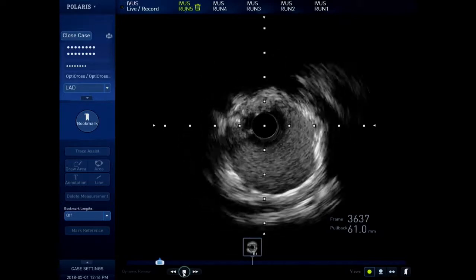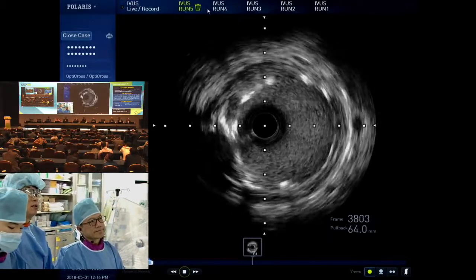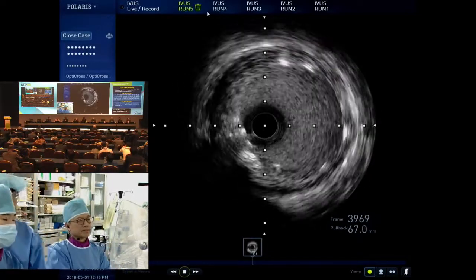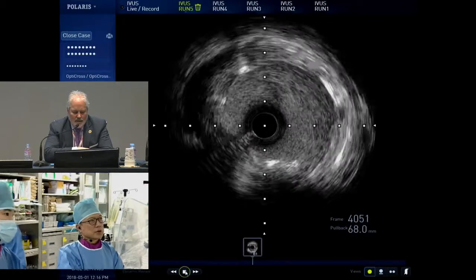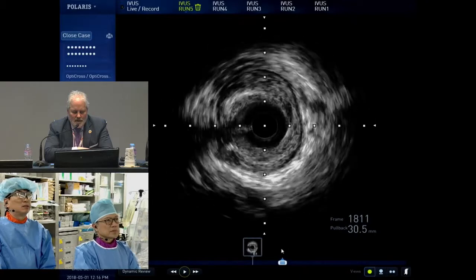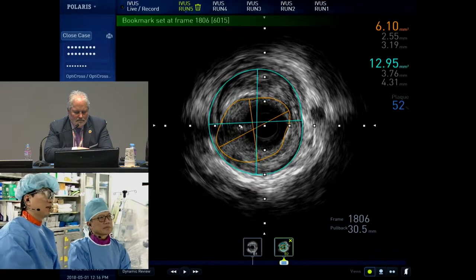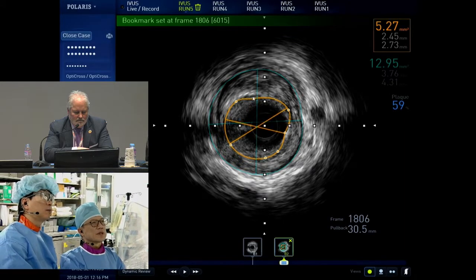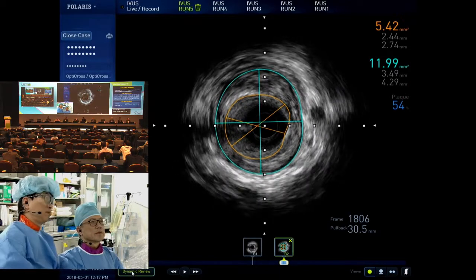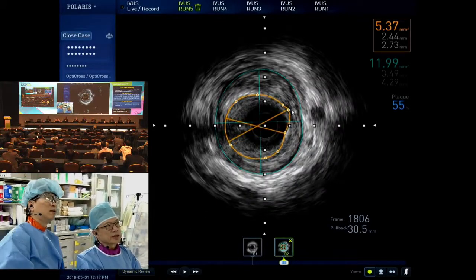This is the tightest portion before treatment. Alan, it looks like that mid-LAD lesion is going to be 4.5 square millimeters or so. And at that location, it's probably the tightest portion of the non-stented segment. It's smooth. I agree with you. I try to leave it alone. Yeah, this portion. Could you measure? Yeah, so we're going to measure the MLA there. 6.1. 5.3. Let's see. We'll finish it up. Minimum lumen area 4.5. I think it's smaller than that. Take the 2 o'clock a little bit.